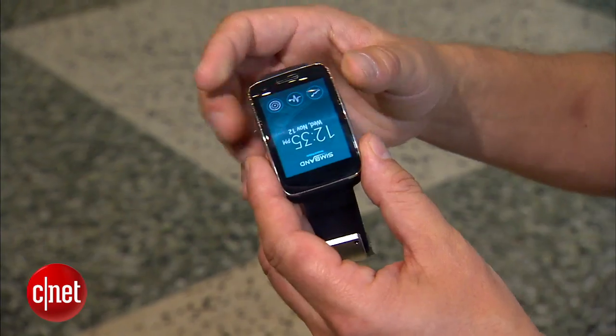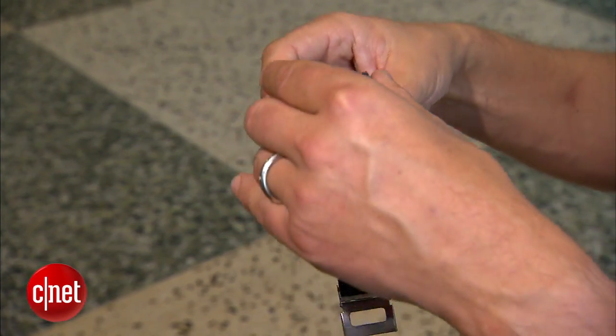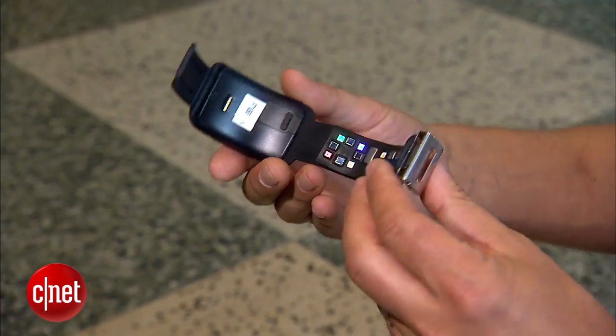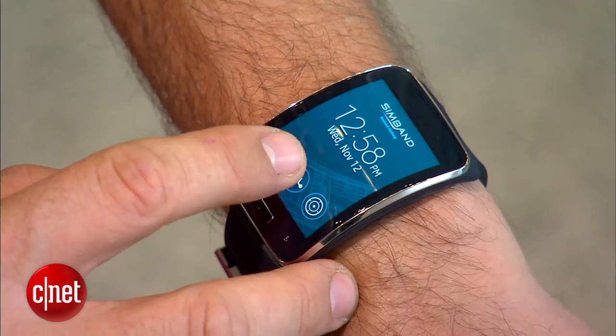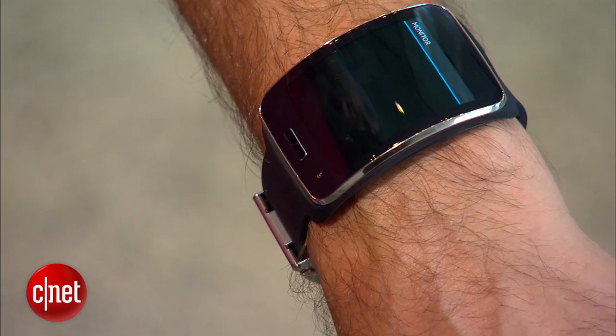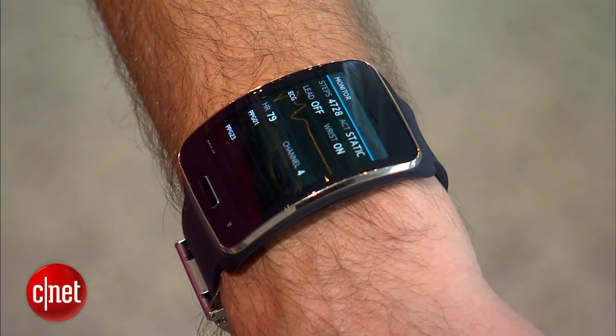So we have what we call Simband, now integrated with the world's most advanced sensor module. This is available for the research and developer community for developing different sensors, algorithms, and applications around digital health. It is not a commercial product, but a reference design to advance digital health.